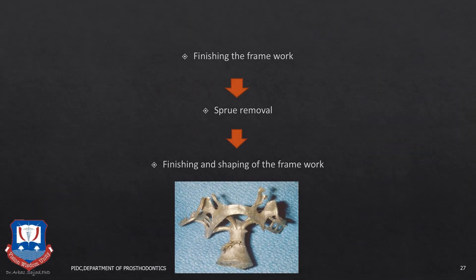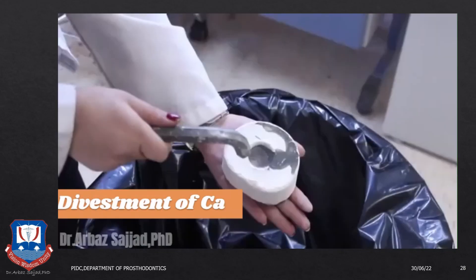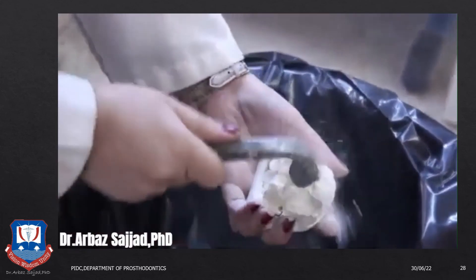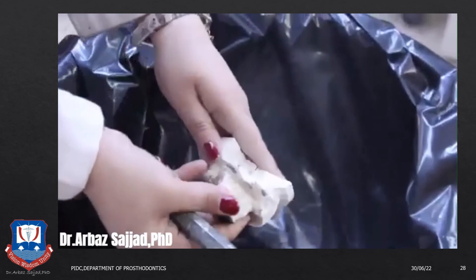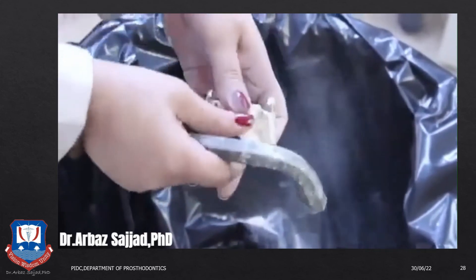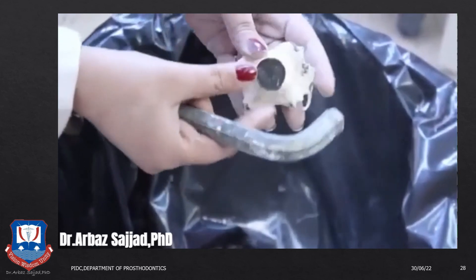Once the framework is cooled down, it is divested, retrieved, the sprues are cut, and the framework is finished. The retrieved framework after divesting still has sprues attached to it along with the reservoir. At the appropriate time, the outer layer of the refractory material is removed by tapping it with a mallet. The resulting investment is then removed by airborne particle abrasion in a self-contained machine. Subsequently the casting is examined for defects; if the casting is deemed satisfactory, finishing and fitting procedures are begun.